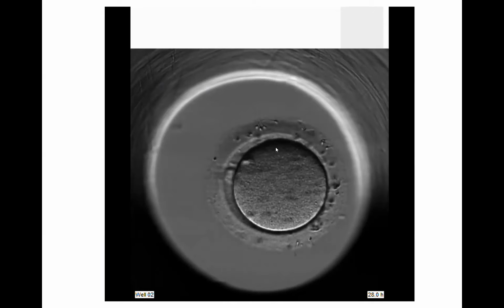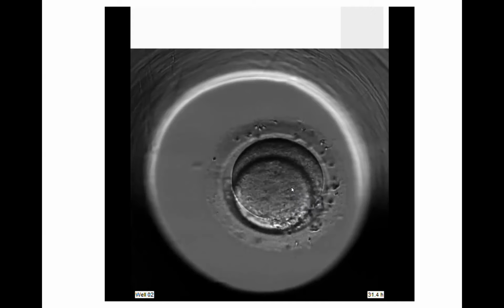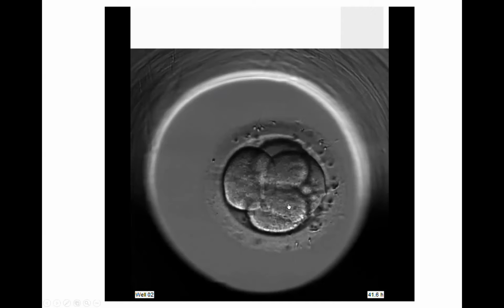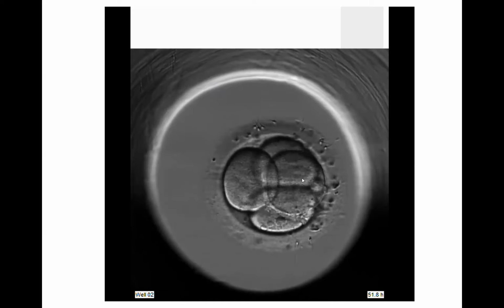You can also see here, and this is pretty cool, this was a conventional insemination case, because you can see all these little sperm on the outside of the egg. These are all the ones that really tried, but they didn't win. 1 sperm got in. So what you can see is the embryo is going through changes now. It is starting to divide, and it goes from 2-cell, and then it'll go to 3-cell. So it's not like people usually imagine, where it goes 2 to 4. It doesn't do that. It goes 2 to 3 to 4 to 5. So it's one at a time, and everything is staggered, and that's what's really normal. You can still see right here on the outside some of that sperm still kicking, but it's not getting through.